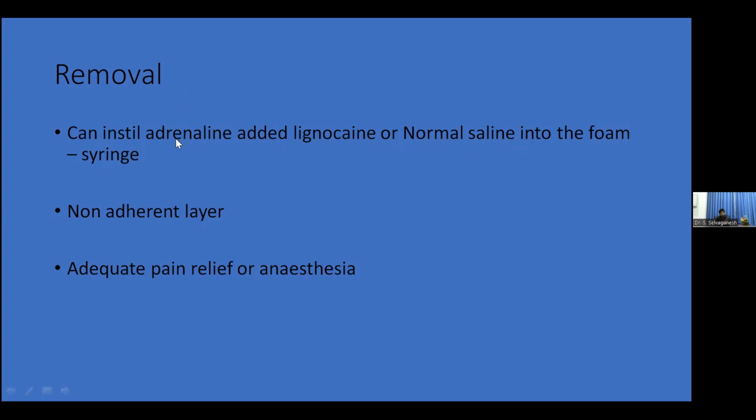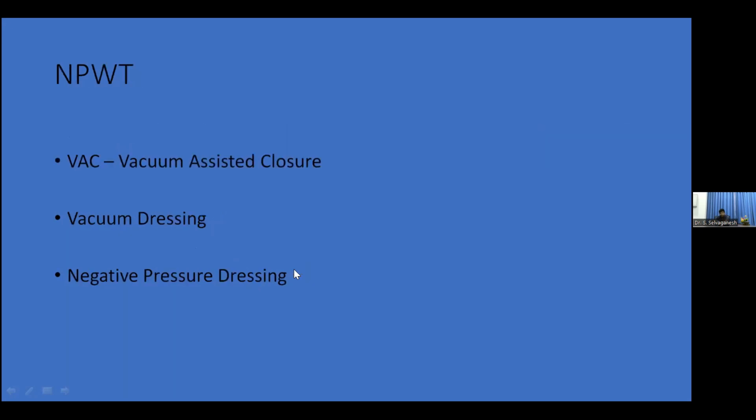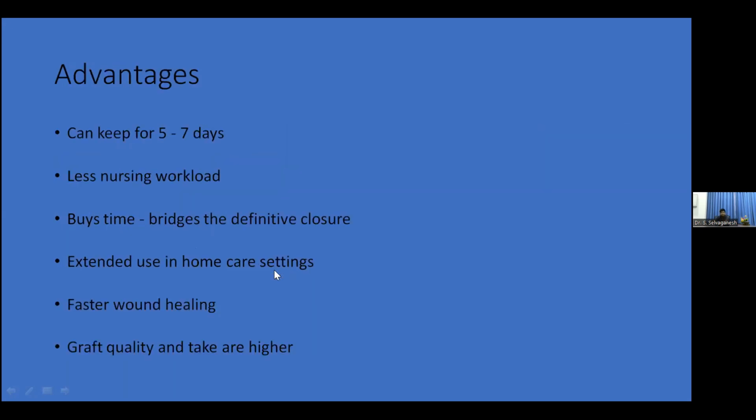Otherwise, the foam gets pasted to the wound surface, and when we are removing it, there can be oozing. So sometimes I put a bit of Vaseline inside and then apply the foam. Before removal, it is better to give adequate pain relief. So these are the names.